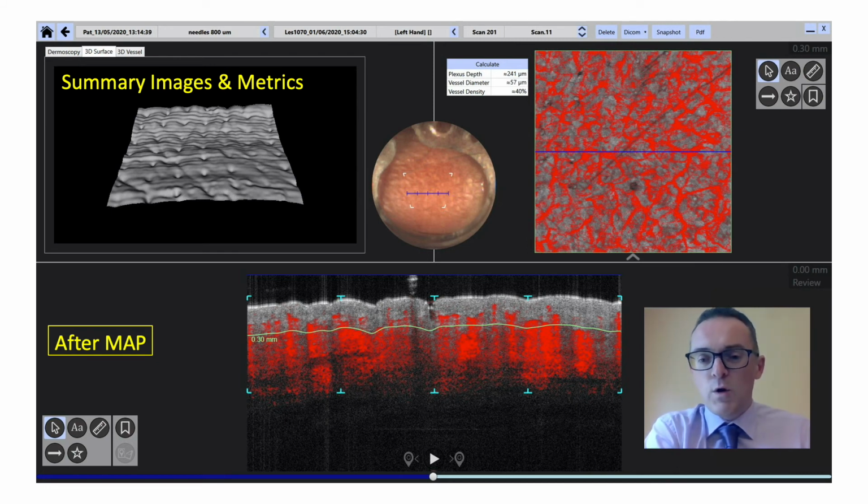We can also use optical coherence tomography to study this erythema as it resolves. We can make measurements associated with the vascular changes associated with microneedle insertion, and then show that this erythema is short-lasting and quickly resolves. Another important application of the technique is that we can do this in human volunteers in vivo.